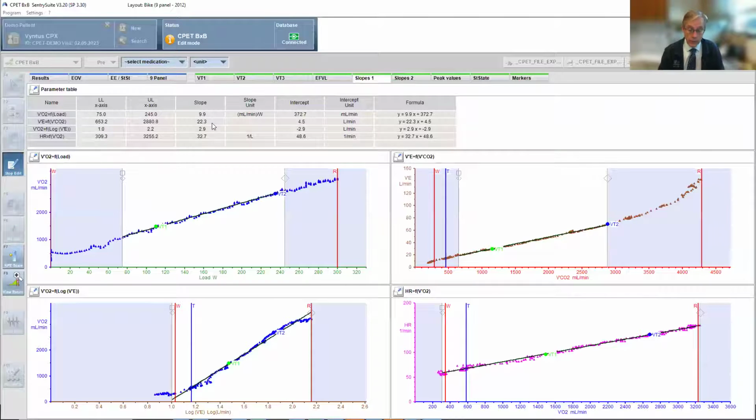So you want to be looking at these graphs to make sure that the technician or whoever's reading them for you has actually constrained these appropriately. So I know that's kind of a lot, but the major point here is that you should be using your software when you have an interpretation center or computer to actually pull it up, look at the actual study, and adjust it as needed. So, okay, I think that's good.